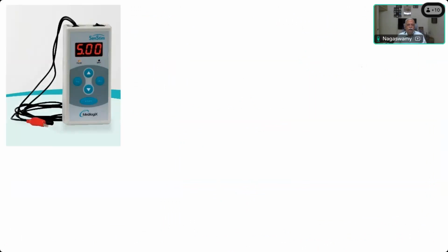What is this? Peripheral nerve stimulators. Peripheral nerve stimulator or monitor for NMJ? Yes, sir. Peripheral nerve stimulator. Nerve stimulator for block. Okay, so this is the peripheral nerve stimulator for nerve block. The maximum current you get is only 5 milliamperes, and you can reduce it up to 0.1 or 0.2 milliamperes to identify the nearest placement of the needle.